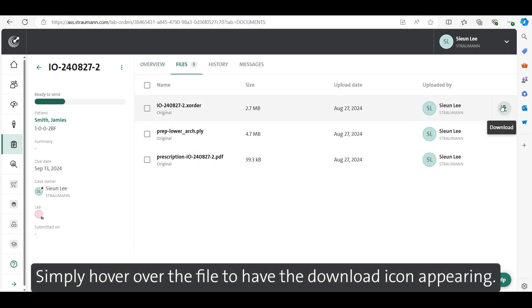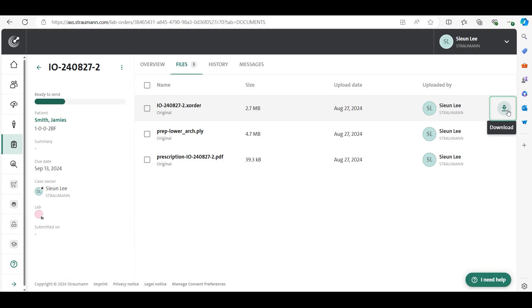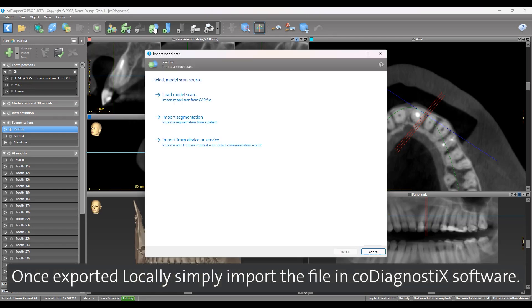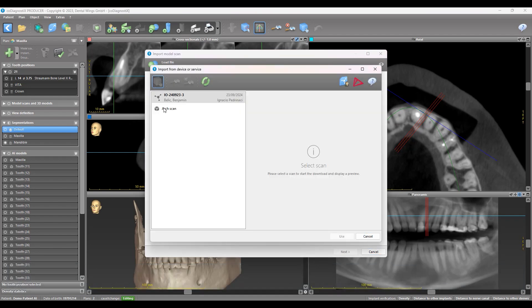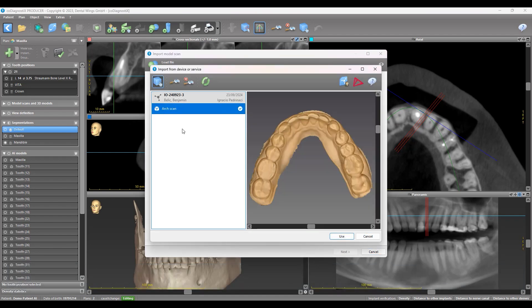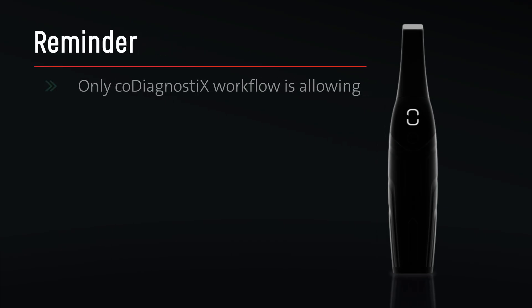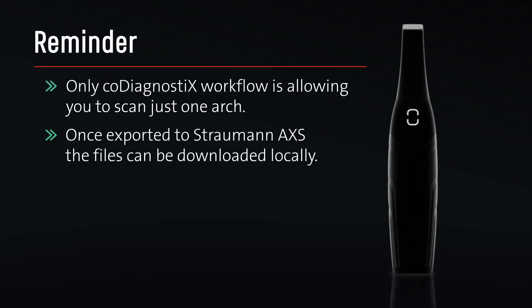Simply hover over the file to have the download icon appear. Once exported locally, simply import the file in the co-diagnostics software. Reminder: only the co-diagnostics workflow allows you to scan just one arch. Once exported to Straumann Access, the files can be downloaded locally.